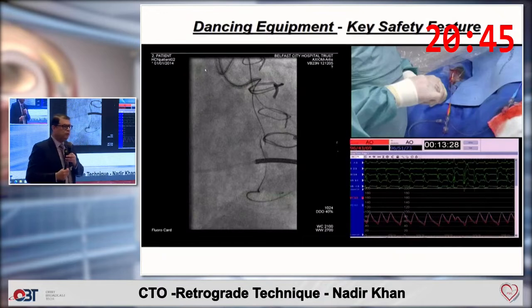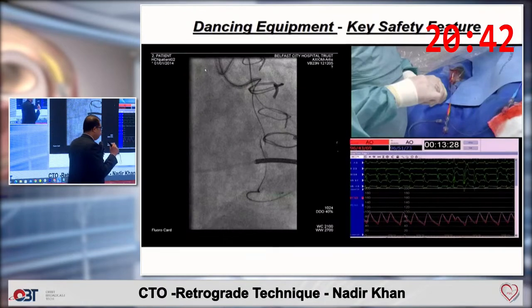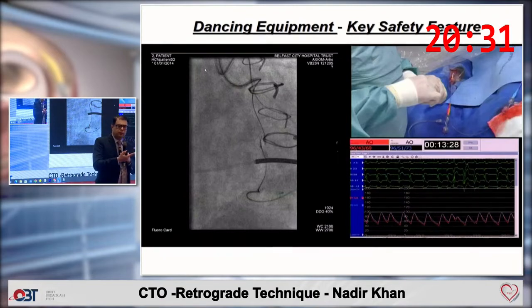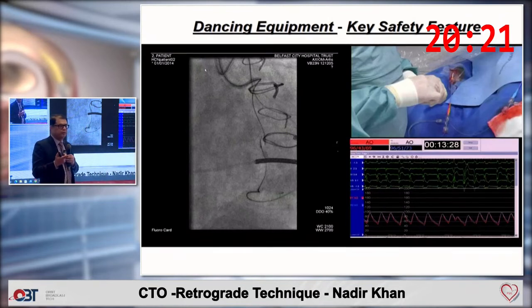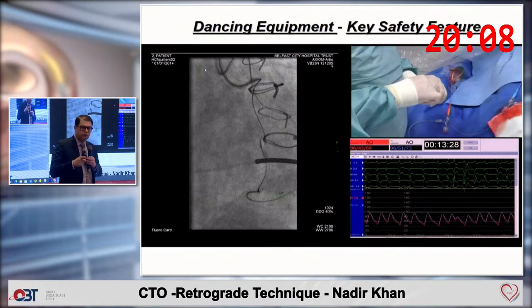This is a very important question. Whatever wire you are using for crossing the channel, for example, a Sion Black, try and take the Sion Black as much as possible retrogradely. If it goes smoothly, very well. If it doesn't, then we shift to a polymer jacketed wire. The advantage is that you can knuckle it also, and you can take the knuckle up till the proximal cap, then antegrade. The other thing is that sometimes you are unable to puncture the distal cap with a polymer jacketed wire. Then you have to take a stiffer wire, most likely a Gaia Third, to puncture the cap.